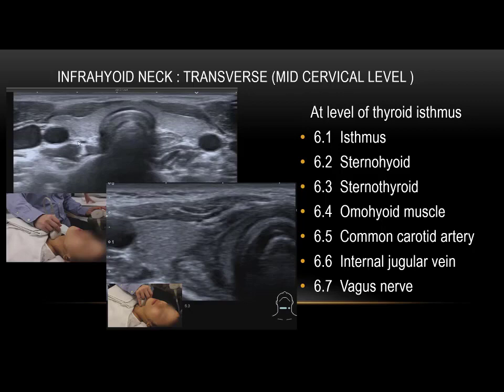Okay, and next, the lateral landmarks. The structures that we need to know are the common landmarks for vascular structures in the carotid sheath, including the common carotid artery and internal jugular vein. Also, there's a small dot-like structure here between the carotid artery and jugular vein. It is the vagus nerve, which is located within the carotid sheath. And the bigger muscle more laterally here is the sternocleidomastoid.